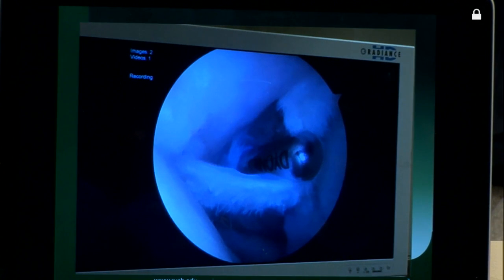This is what her biceps looked like when we started — this correlates with our clinical finding. You can see significant fraying and partial tearing, so the biceps was released and we'll take you into the shoulder joint at this point.